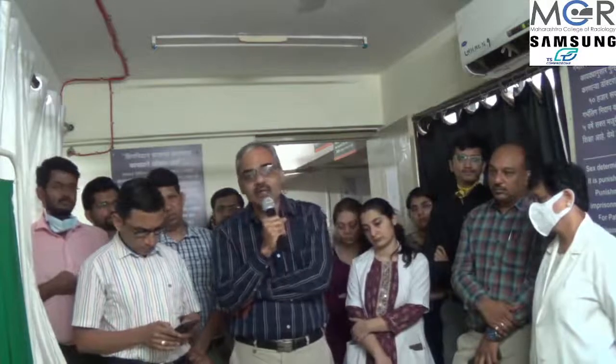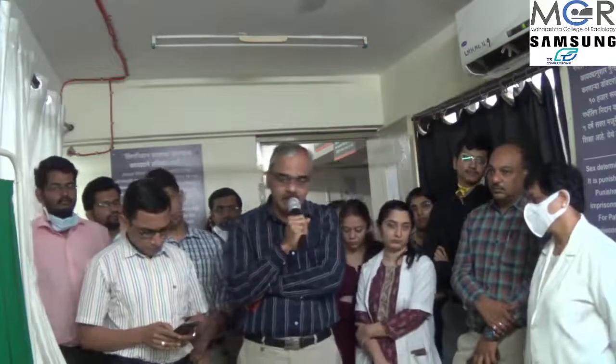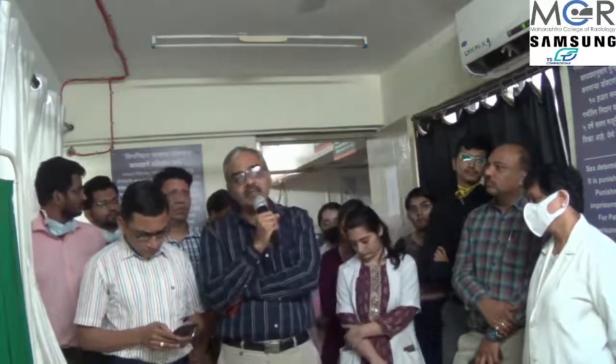I think MRI is an excellent modality to evaluate pelvis and its various pathologies. But ultrasound definitely is a great screening plus evaluating tool, and in most of the cases when we can conclude definitively on ultrasound, we need not go for MRI. But in inconclusive cases or where there are mixed features, definitely we should take help of MRI, and that should not be forgotten.